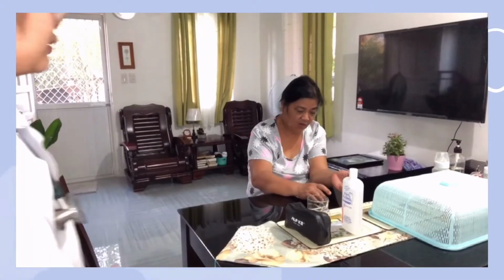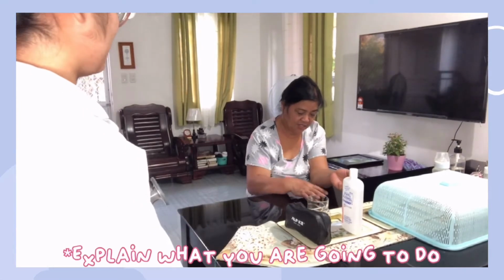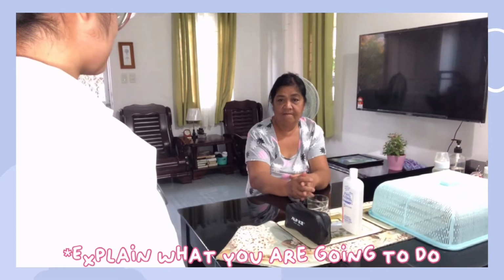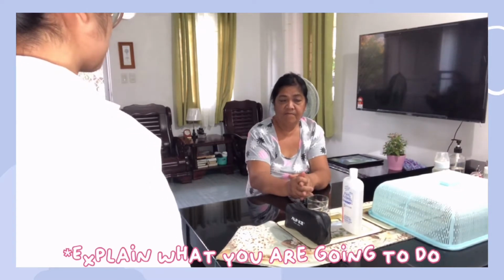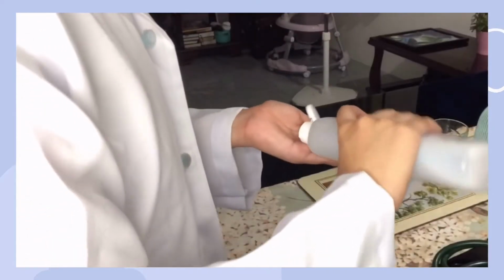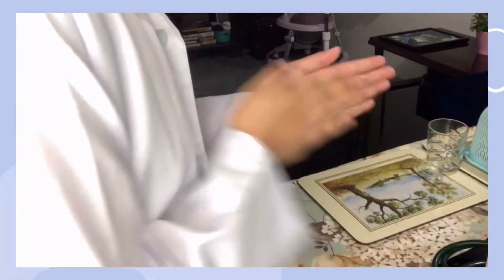For the implementation, prior to performing the procedure, introduce yourself and verify the client's identity using agency protocol. Good afternoon, my name is Danielle Villaseñor. I'm a student nurse from NEUSTCON. So first, may I know your name, please? Miss Riorita Villaseñor. Okay. So, Miss Riorita, I will be taking your blood pressure. Next step, okay with you? Okay. Second, wash your hands and observe other appropriate infection control procedures.